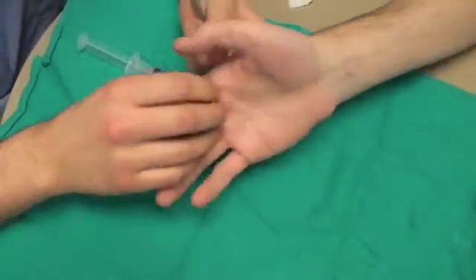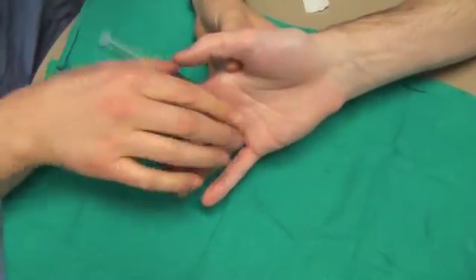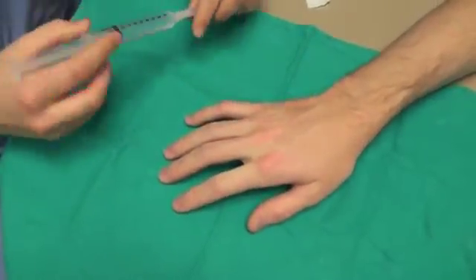We do want to anesthetize the digital nerve that runs on the volar aspect of the bone, and therefore need to pass the needle to the appropriate depth just on the volar side of the metacarpal.